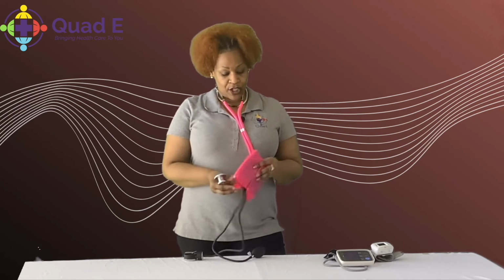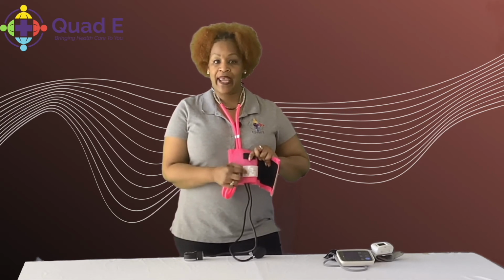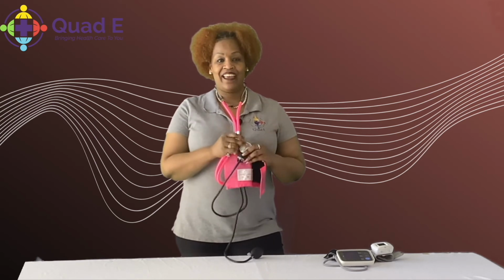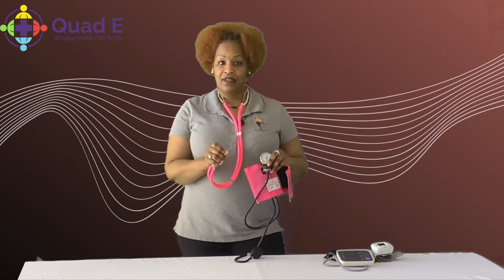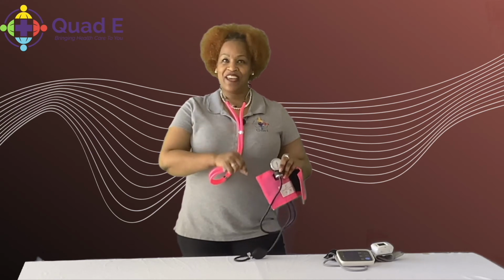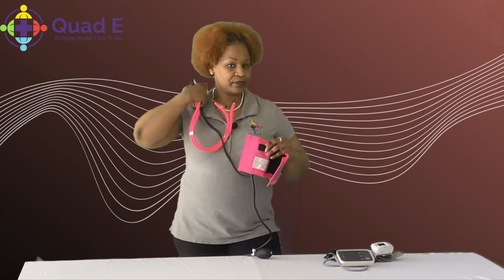Okay, now for this one right here, this one is the manual one, like I did say. You want to make sure that it is lined up, and depending on which one you have, it goes on the left arm or right arm, so you want to make sure the arrow matches up. Okay, this is the one that you inflate and deflate. And when you inflate it and then deflate it slowly, you want to write down the first loud sound, and the last heavy sound, or the loudest, that is the last number you want to put. Okay?